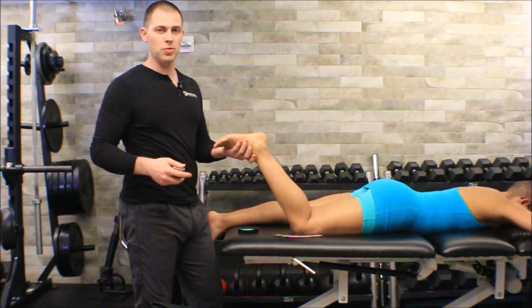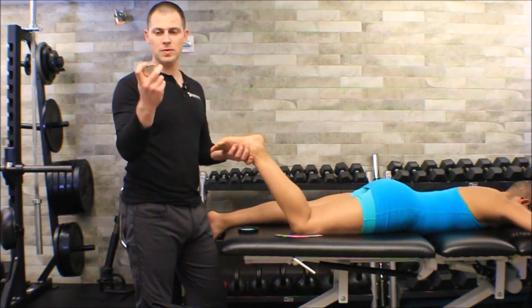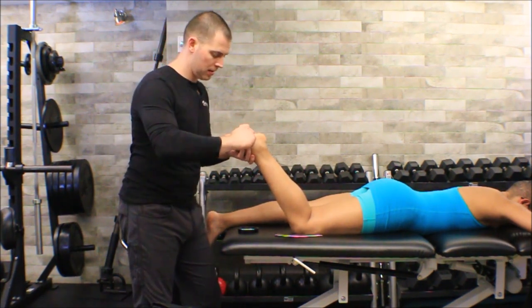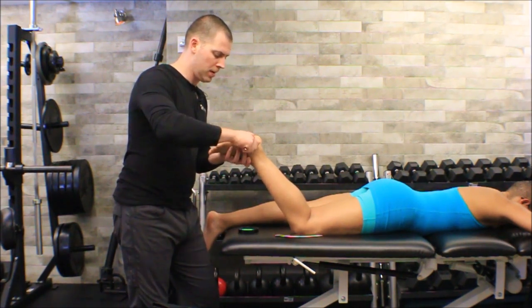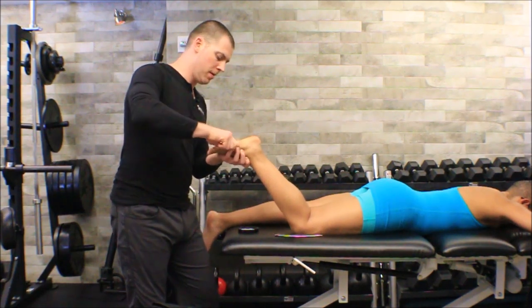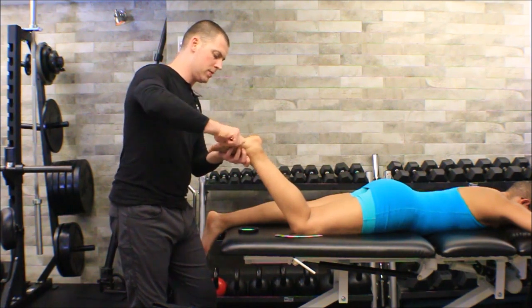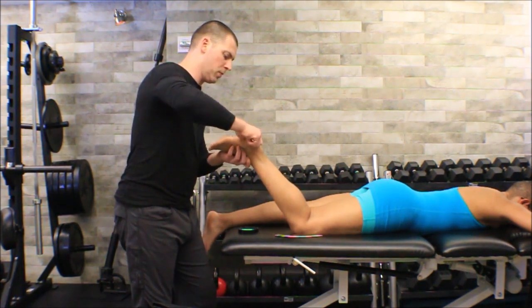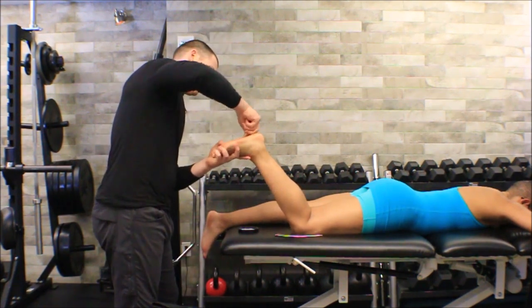Now, if I wanted to maybe frame the different sides of the foot, I could use this corner in here, kind of come across like so. All right, I might not be able to go in a lot of different directions there, but at least I'm affecting that fascial tissue a little bit with repetitive stretch and some shearing force. Come through this way.